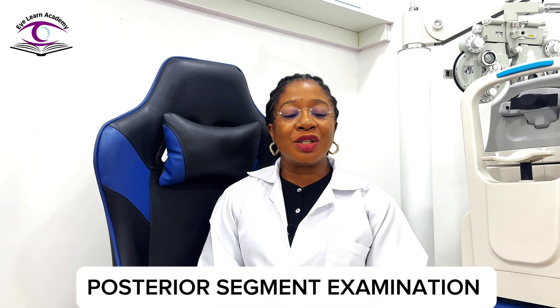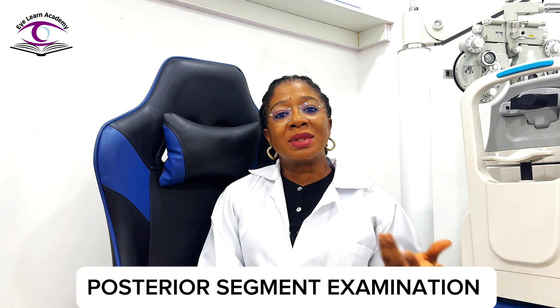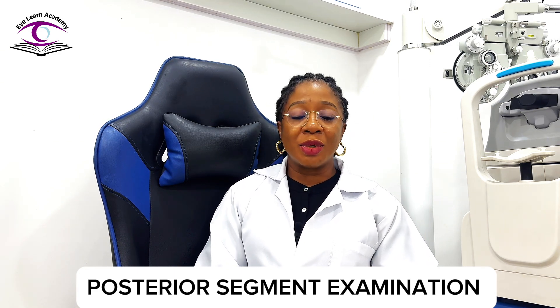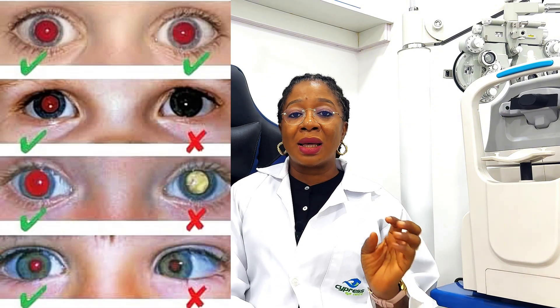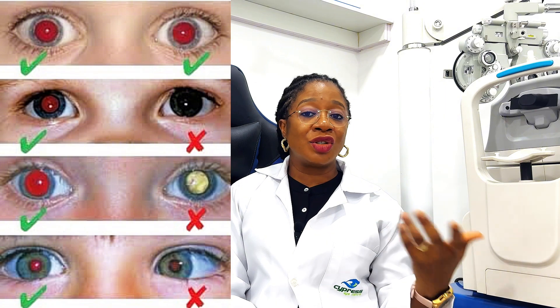Let's move on to the examination of the posterior segment. Talking about the posterior segment, we are looking at the vitreous and the fundus. If you're looking at the fundus, you are observing the retina, the optic disc, the vessels, and the macula. When you shine the ophthalmoscope into your patient's eye, first observe the red reflex. When there's an absence of the red reflex, that means something is going on — such as corneal scars, cataract, vitreous hemorrhage, or asteroid hyalosis.